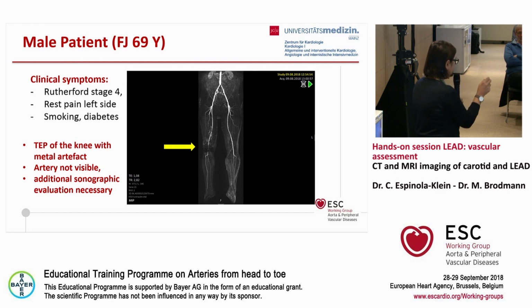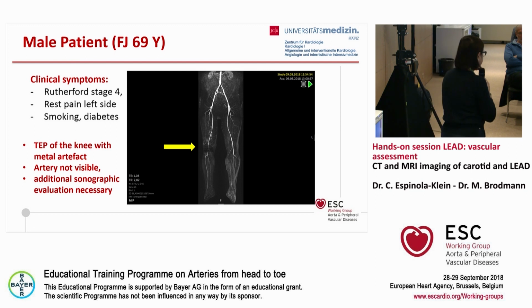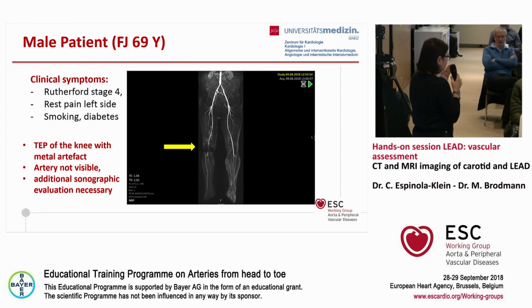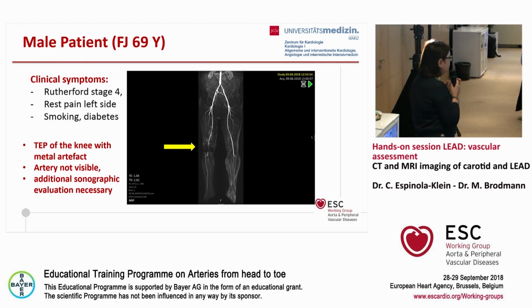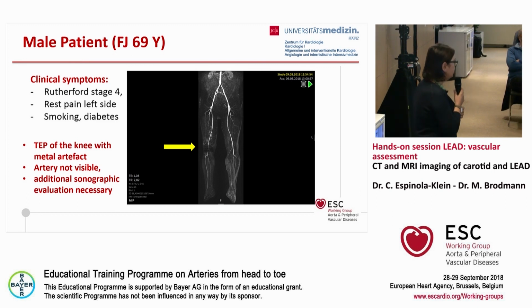And this is really the only thing: the whole calcification of the leg can be better detected by a CT scan than MRI. This is just really the indication. Or if they have a pacemaker, if they cannot lie in, or if they have a phobia, just to get into these really tight MRI machines. Or metal implants like hip or knee prosthesis or whatever. So these are indications for CT scan, and especially the degree of calcification, as Muriel has pointed out.